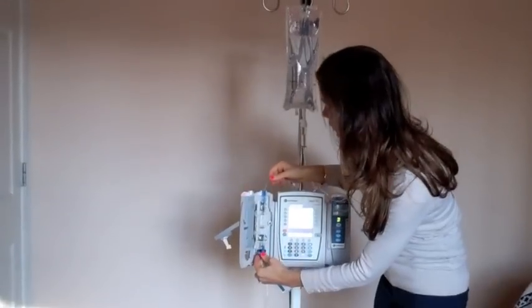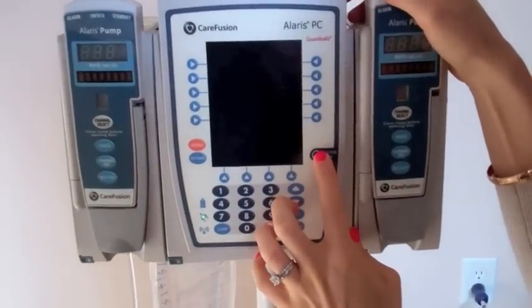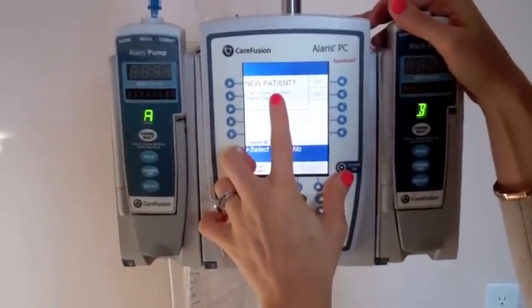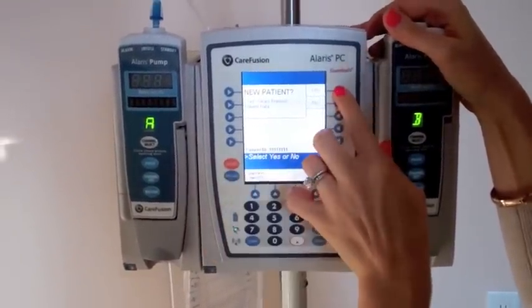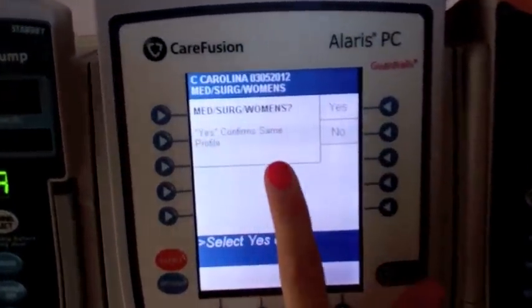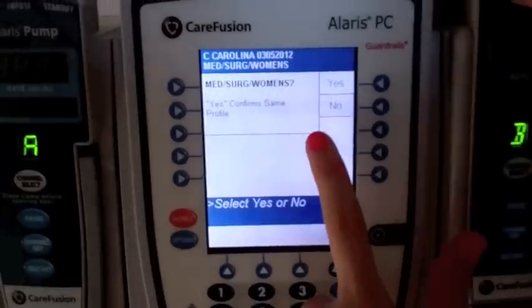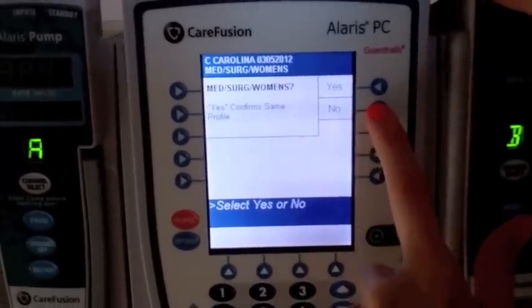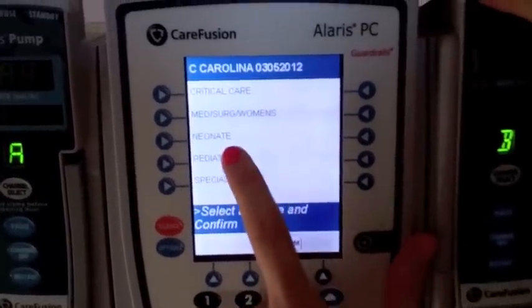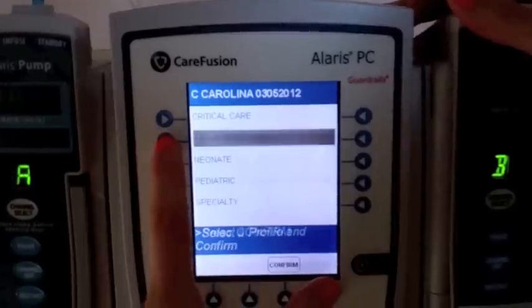We're going to insert it into the pump. So we have our pump right here — we're going to turn the pump on. The first screen is always going to ask us if this is a new patient, which we're going to say yes. Then it's going to ask us which area we are working in. You have options: critical care, med-surg, women's, neonate, pediatric, or specialty. For our purposes, let's just say med-surg.